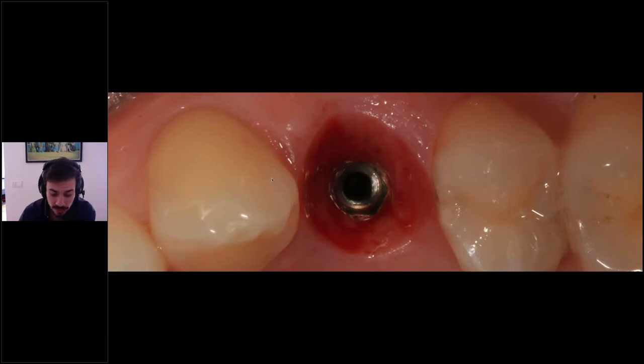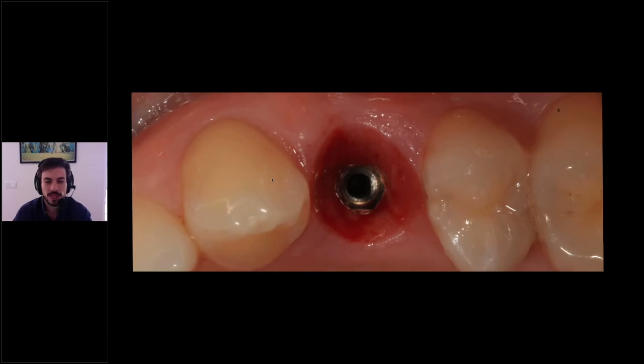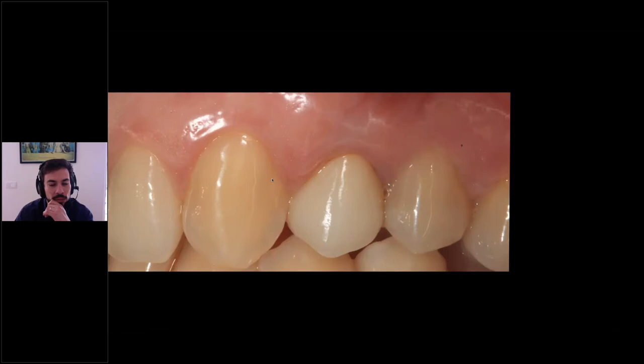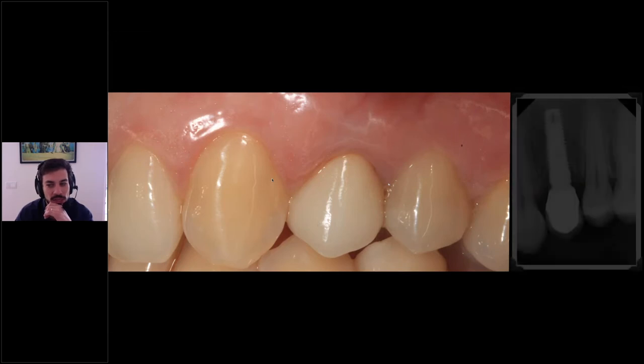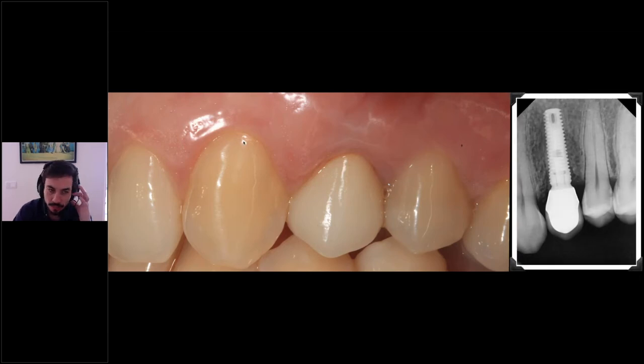What we implant surgeons all want is to give this kind of emergence profile back to our prosthodontists. So this kind of emergence profile will allow us and our prosthodontists to make restorations like this, with complete integration in the soft tissues, and have X-rays like this with minimal marginal bone loss.